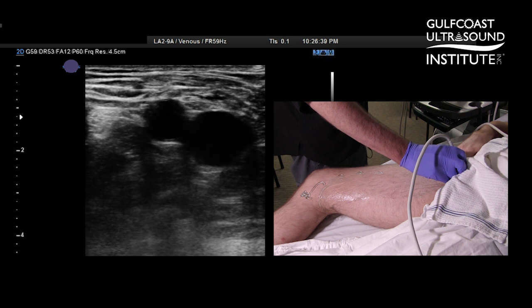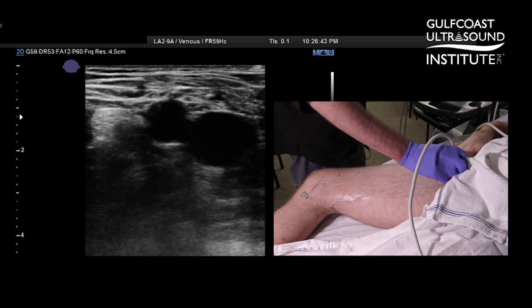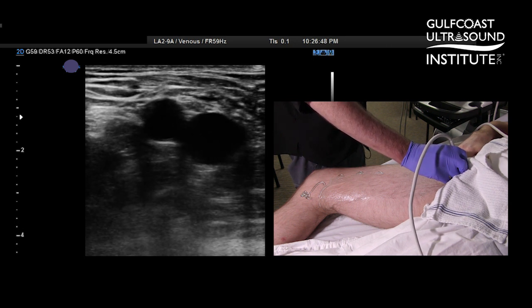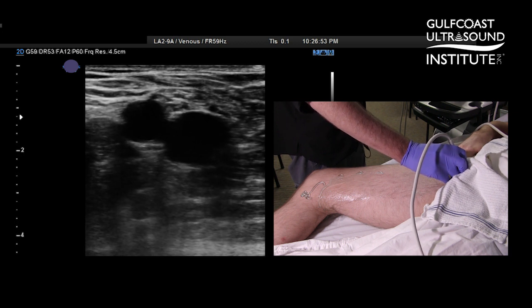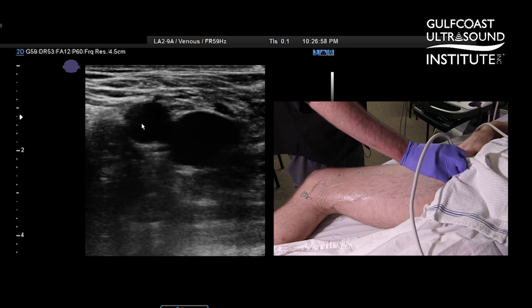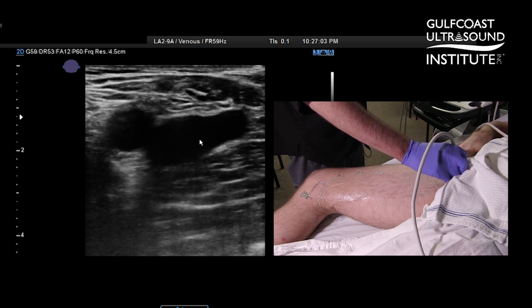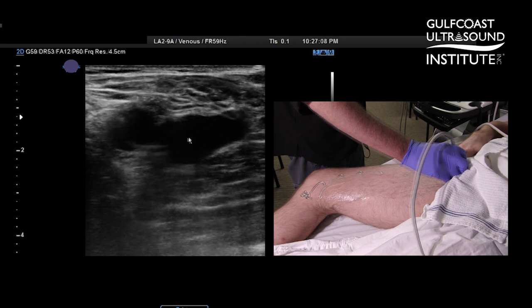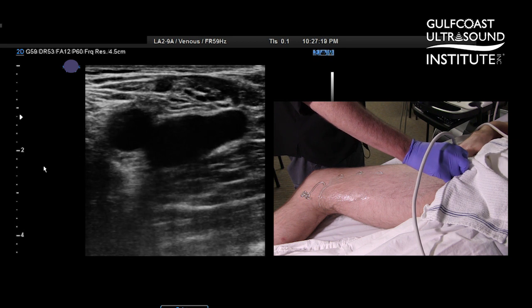To perform a quick point-of-care compression study on a lower extremity, it's pretty basic. First of all, pick up a high-frequency linear transducer, indicator toward the patient's right, start high up on the groin so you can see just two vessels — the common femoral artery and common femoral vein. A good place to start is the saphenofemoral junction, where we're seeing the saphenous vein draining into the common femoral vein.